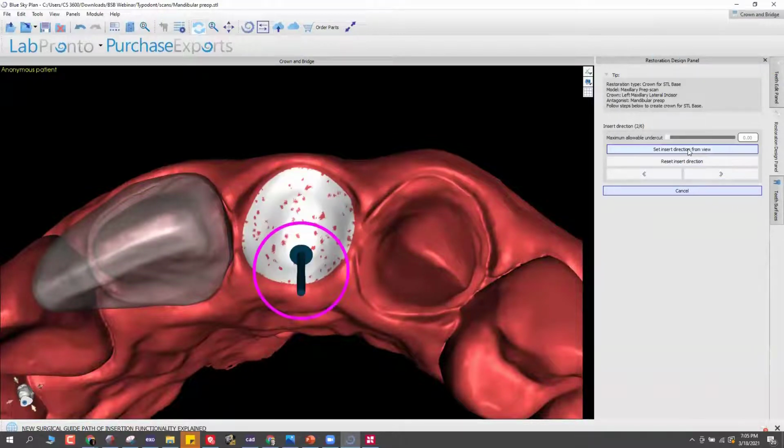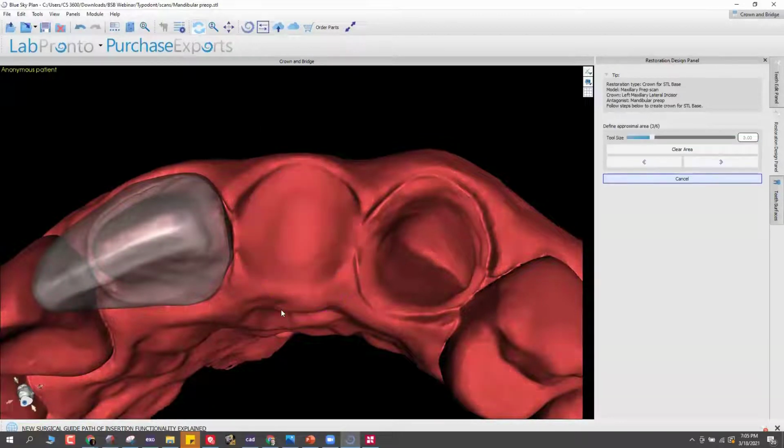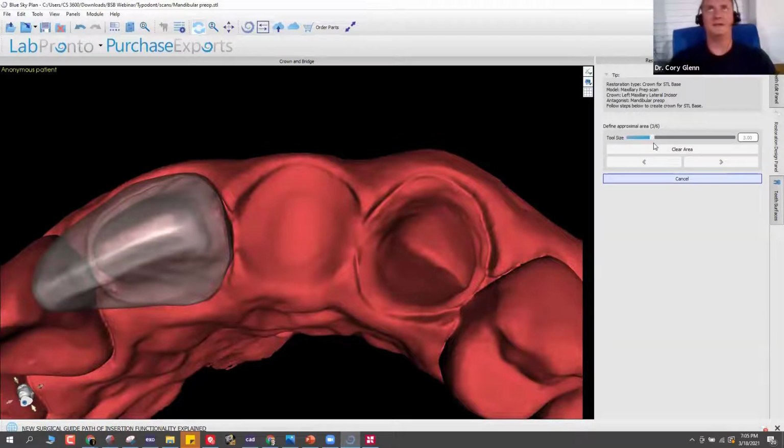What is the longest edentulous space in a full arch provisional that you have successfully designed? Longest edentulous space, all the teeth, because again, I've used these on full arch hybrids, so there's no teeth in those. But I'm sure it says on the indications, because that's usually something that has to be included on the FDA form when they're getting approval.